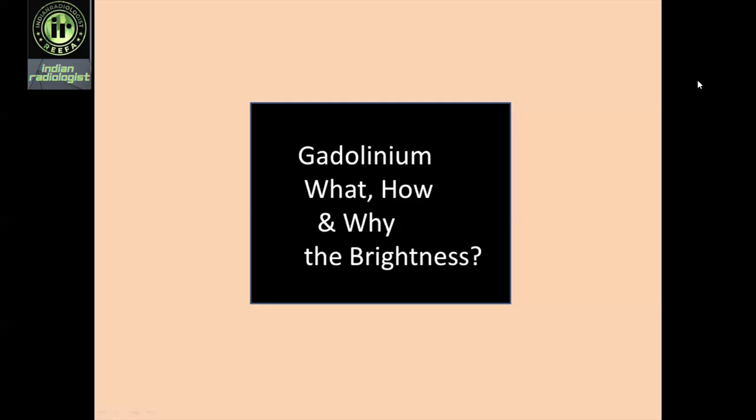And I want to clarify this myth, because unlike barium and iodinated contrast media on CT, which themselves appear bright on the scans, with gadolinium it is a different scenario. It is not the gadolinium itself that appears white, but the neighboring water molecules which are influenced by the gadolinium. We will discuss how this happens.